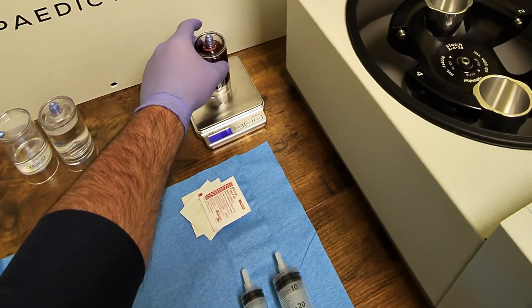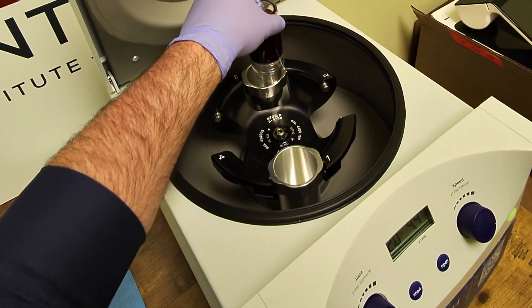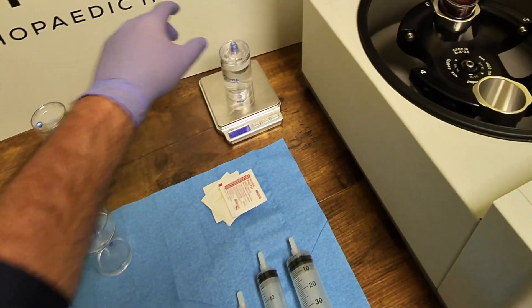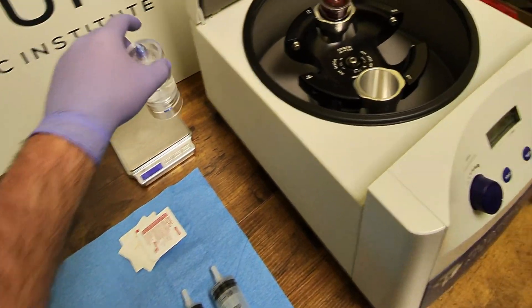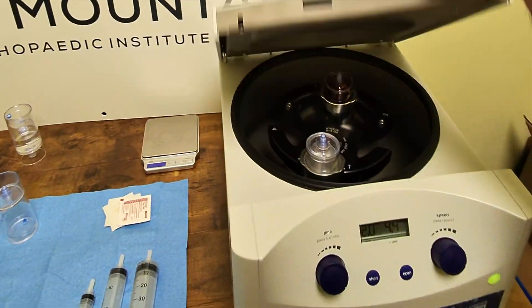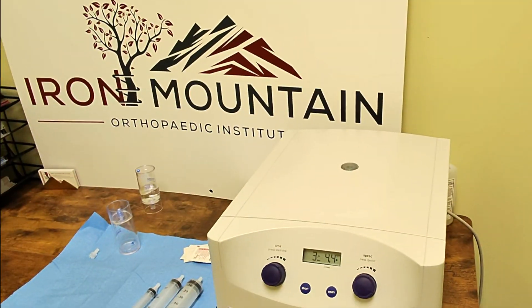Once transferred, the separator device and the blood are weighed and placed into the centrifuge. A counterbalance is also weighed to ensure it is within 3 grams of the weight of the separator device, and placed at the opposite end of the centrifuge to create stability during rotation. The first spin is at 4,400 RPM for 2 minutes.